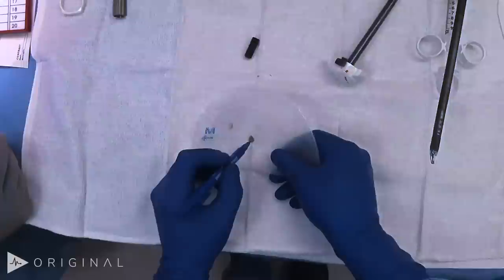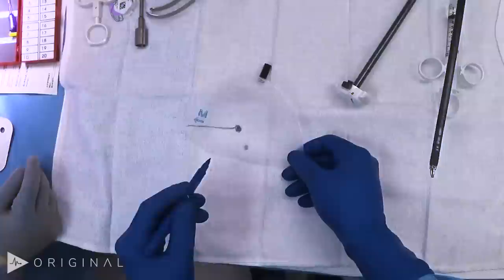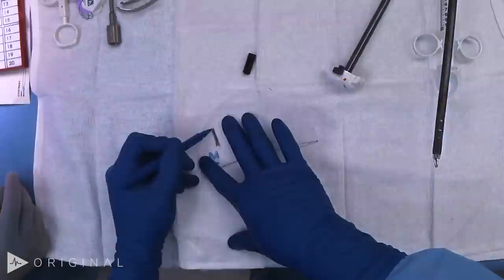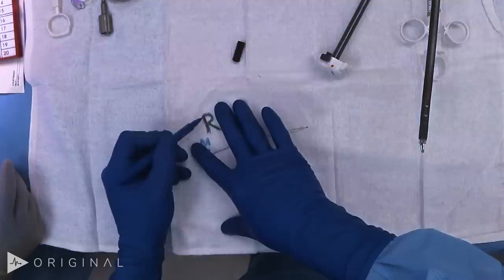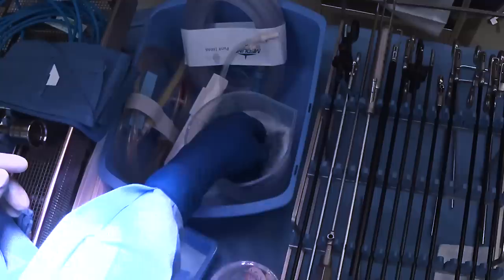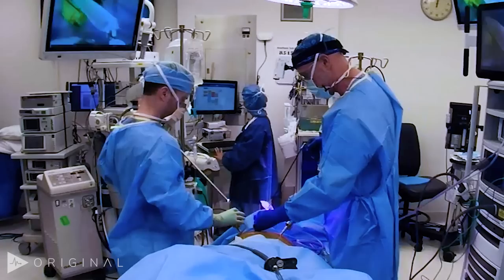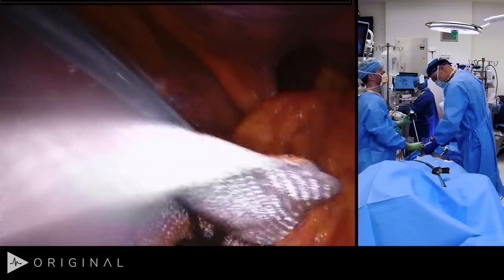I tend to mark the mesh so I can identify orientation robotically: this is where Cooper's ligament goes, this is where the iliopubic tract goes, the inferior epigastric comes up like this. Since we're doing a right side, I put the letter R on the medial side — if doing bilateral, I mark both to avoid confusion. Then we soak it in bacitracin and introduce the mesh now. You don't need to roll it up; if you do, you waste time unrolling it intra-abdominally. Just insert it through the port and it'll go through without furling.